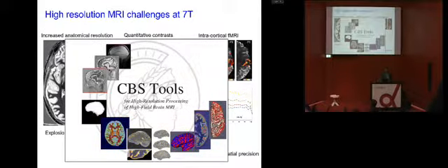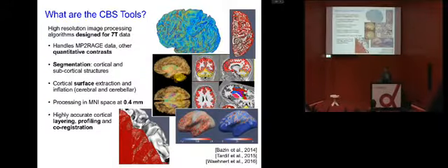So that's where I started working quite extensively on building a toolbox for this kind of purpose, the so-called CBS Tools, specifically to go through all the steps to do what people do normally with things like FreeSurfer or SPM or FSL: getting the images into structures, labels that you want to use, going into cortical laminations, measuring depth, and so on.